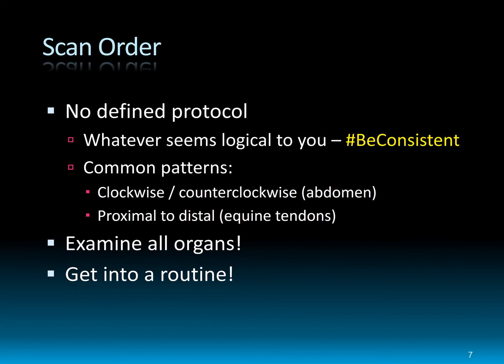As far as the order of going through the abdomen, it doesn't really matter. Whatever seems logical to you is the best way to do it. The most important thing is that you're consistent, so that you always look at all the organs, you always look at them in the same order, so you get used to what things are supposed to look like, and so you will definitely identify things when they're not what they're supposed to look like.